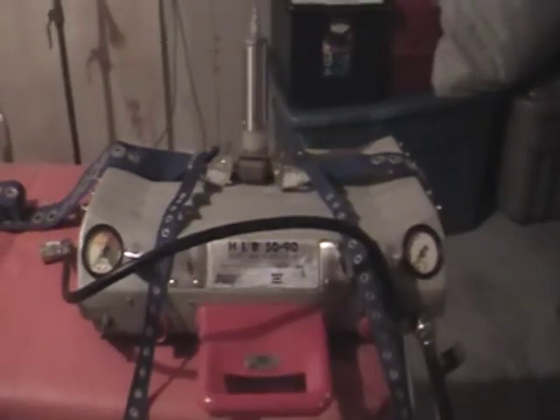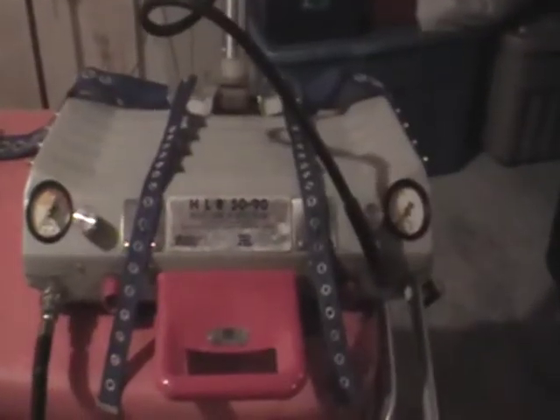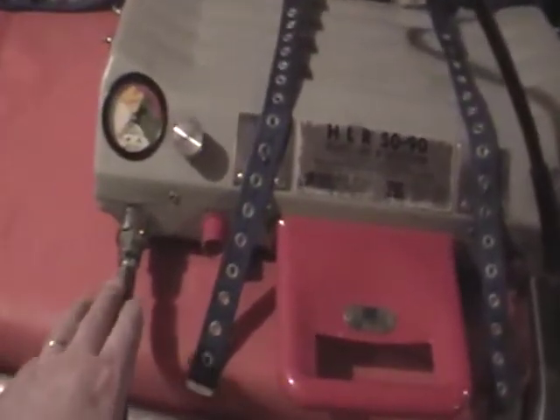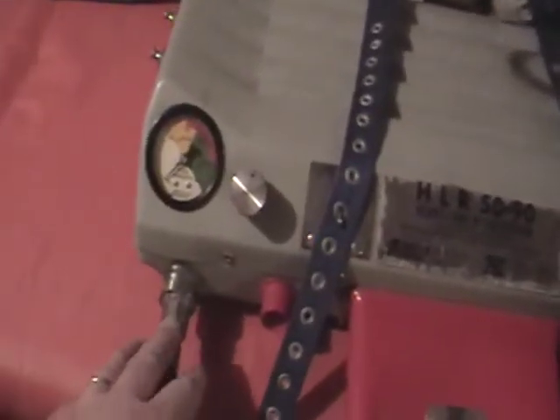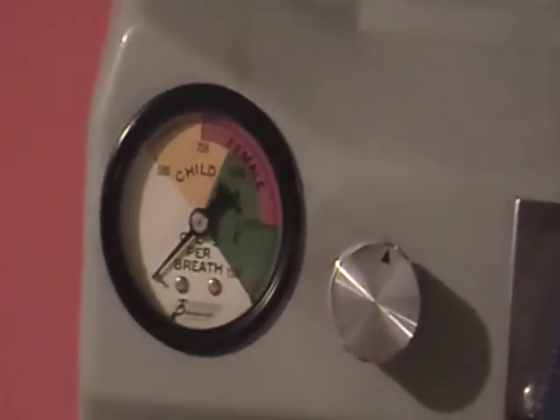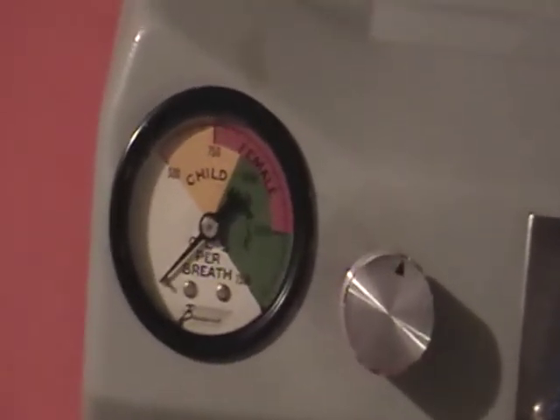The cylinder would be plugged in and the machine turned on to provide CPR. As we saw earlier, if the oxygen supply hose is hooked on this side of the machine, we only have CPR being provided. However, if we hook it on this side of the machine, we have the gauge that controls artificial respiration.